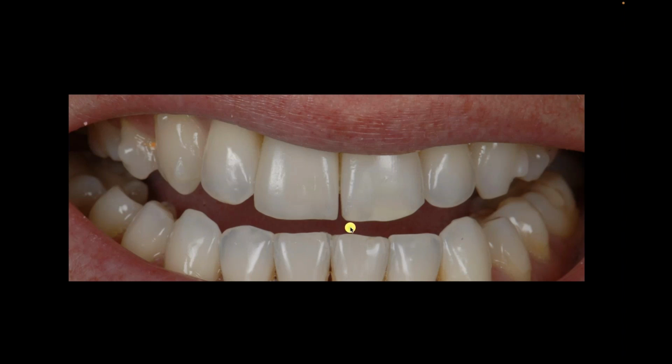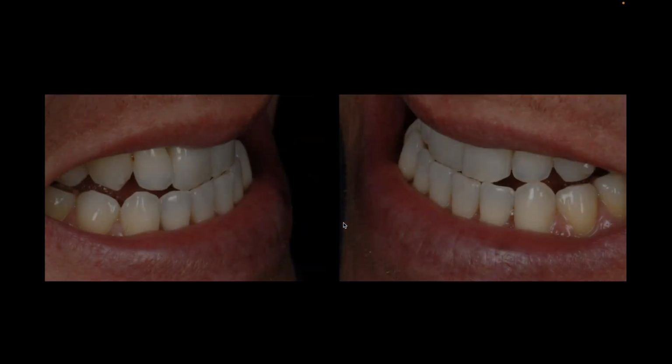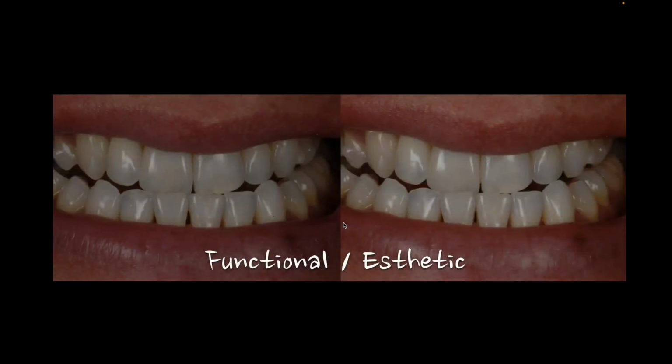No. So my buildup had to shift a tiny bit in order for me to accommodate what I see in the photo next to it. And it was a single implant central, by the way. That was an old one from a bunch of years ago.